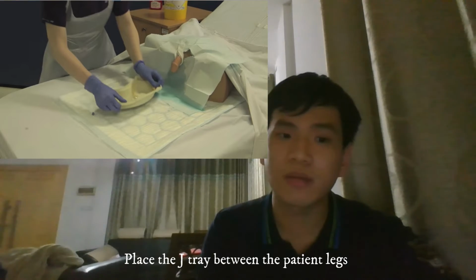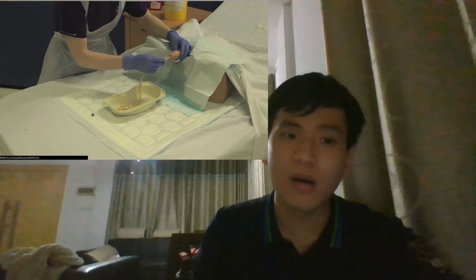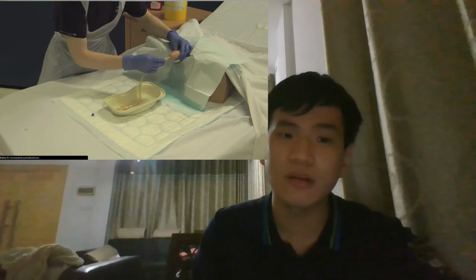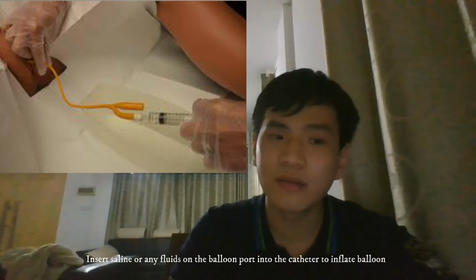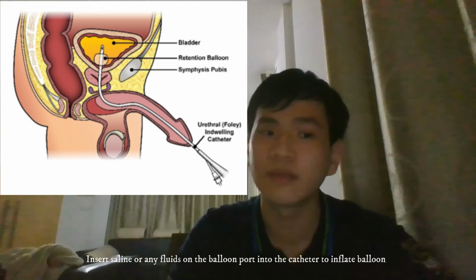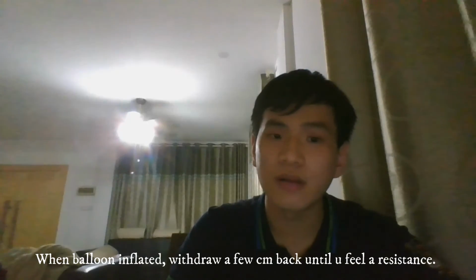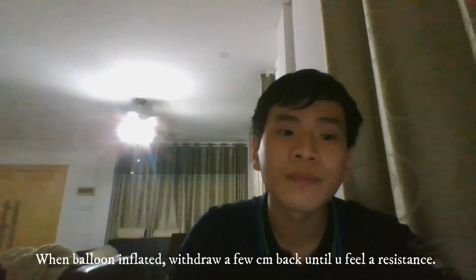Carefully open the catheter from its sterile packaging, exposing only the catheter tip. Without touching the catheter directly, insert the catheter along the urethra into the bladder. Once the urine begins to flow, advance the catheter a further 5 cm. Inject the contents of the syringe into the catheter to inflate the balloon in the catheter, and gently withdraw the catheter to ensure that the balloon is secure against the bladder neck. You will feel a resistance when you try to withdraw it from the bladder.